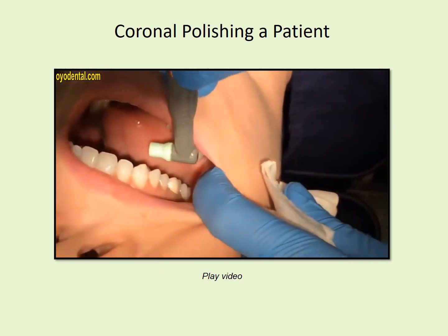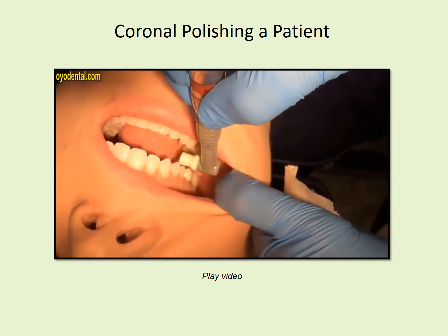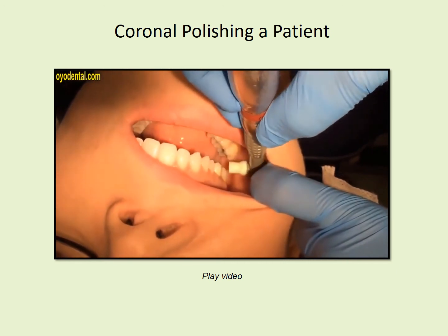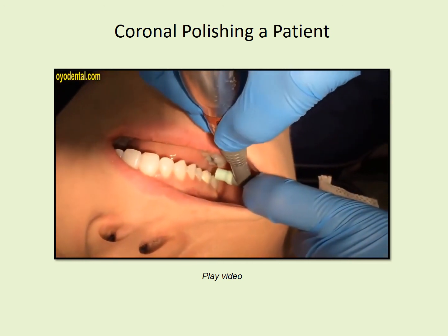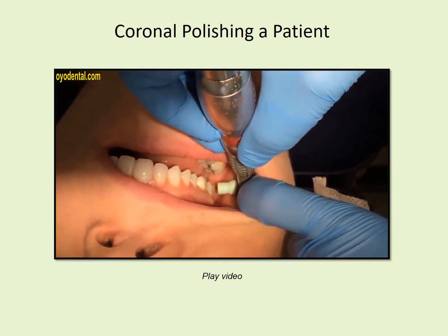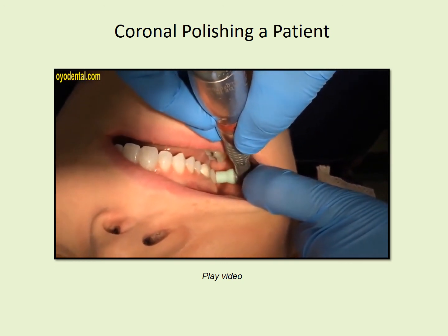Go ahead and turn a little bit away from me, Candy, and close just a little bit. I have my patient close a little bit so I can get more extension on retracting their cheek and have them still be comfortable. What I'm going to do is I'm just going to make sure I come across the gingival margin and then clean the tooth. I'm going to show you the whole mouth. This is one option of the sequence. There are many out there.